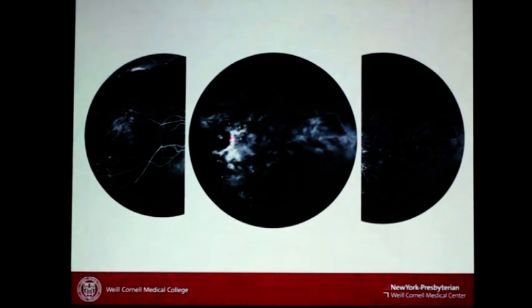In Coats disease, attack these vessels and ablate the peripheral retina here. All right? You can't really do this as effectively. You can still do it, okay? But you can't do it as well without the ultra-wide field fluorescein. And that's what I've learned, okay? But I have the advantage because I have this machine, right?